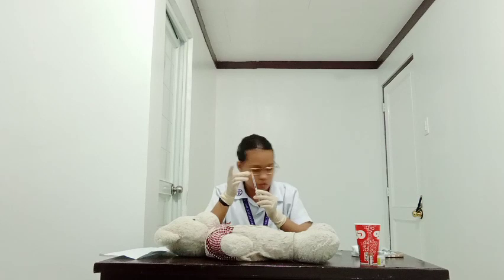Now, we need to remove the needle cap while waiting for the antiseptic to dry. Expel any air bubbles from the syringe. Small bubbles that adhere to the plunger are of no consequence. Also remember that a small amount of air will not harm the patient. So first we need to flick it and dispose of any air bubbles.